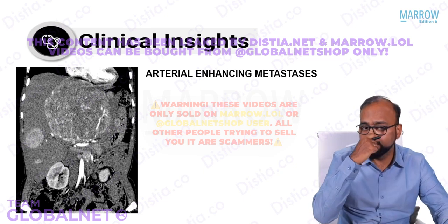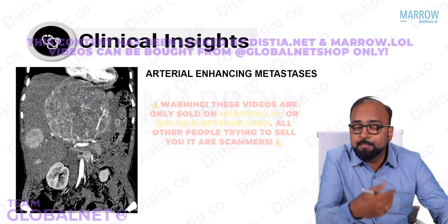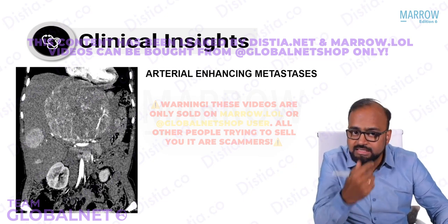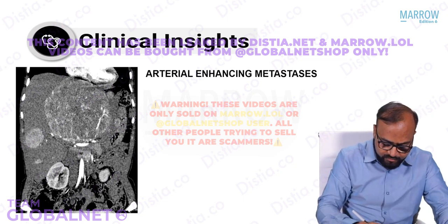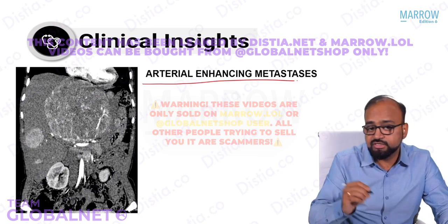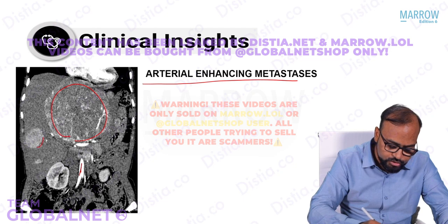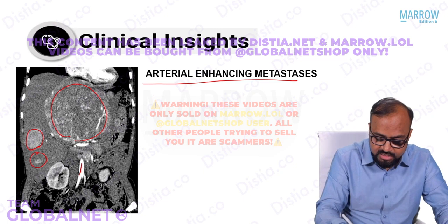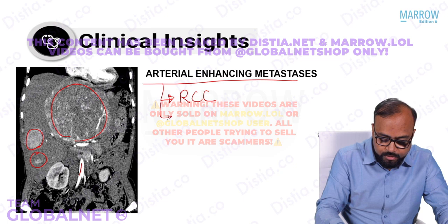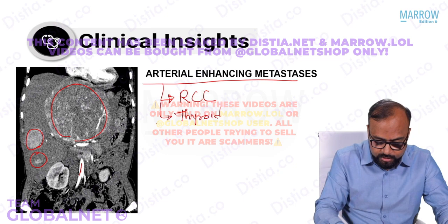Now we have seen liver metastasis, and I told you that most common liver metastases are usually hypovascular metastases. So they enhance less as compared to the normal liver, but there are exceptions in which we get liver metastasis which are arterially enhancing. So this is an arterial phase image. You are able to see multiple deposits within the liver parenchyma. They usually arise from aggressive tumors, such as arterial enhancing metastasis arise from what? They arise from aggressive tumors like renal cell carcinoma, like thyroid carcinomas, like neuroendocrine tumors, right?